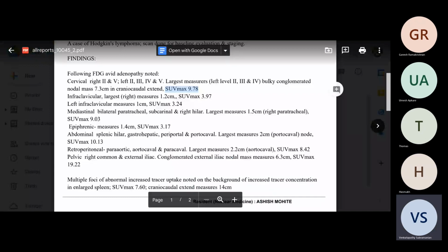So the one thing that we can straightforwardly take from a PET image through programming as an engineer is only the SUV value. That's a straightforward thing that we can take. Everything else will be a secondary derivation that we have to write code for. So one of the functions would be to filter based on the SUV uptake. Like you said, maybe the range might differ widely for HL, but at least we'll have some tentative regions, and then we can go to these regions.